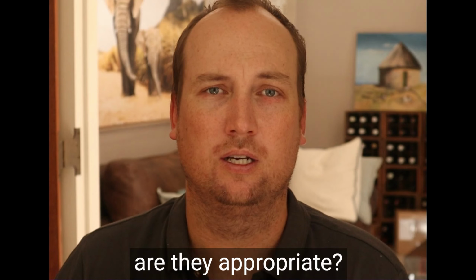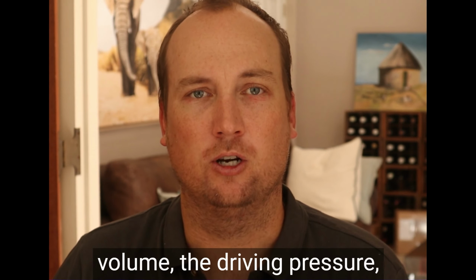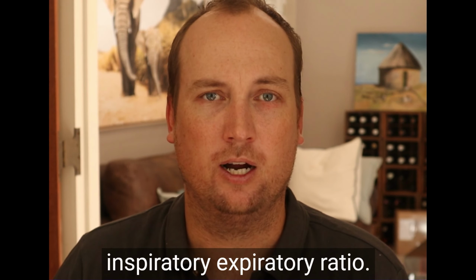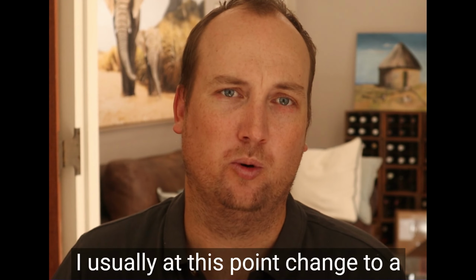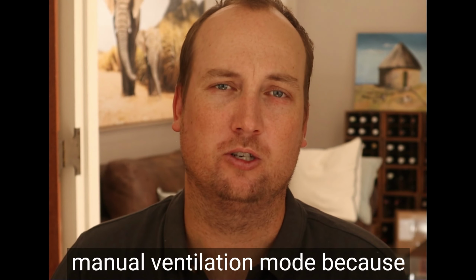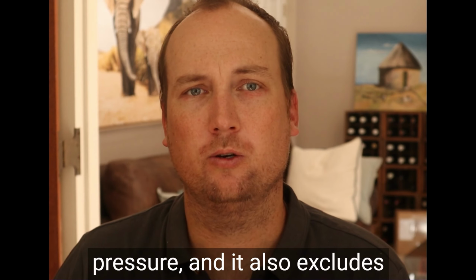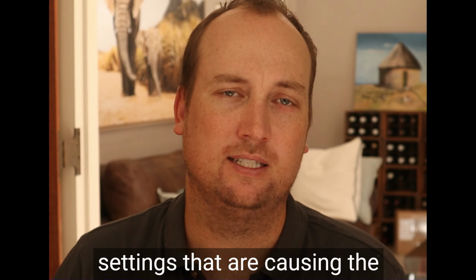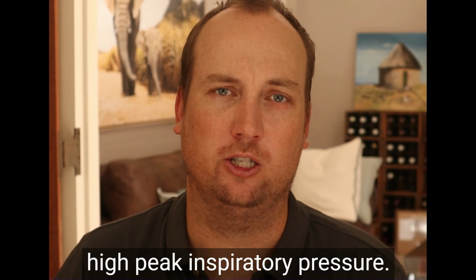Are they appropriate? The respiratory rate, the tidal volume, the driving pressure, the PEEP that I've set in, the inspiratory-expiratory ratio. I usually at this point change to a manual ventilation mode because this gives me a feel for the airway pressure, and it also excludes a ventilator error or ventilator settings that are causing the high peak inspiratory pressure.